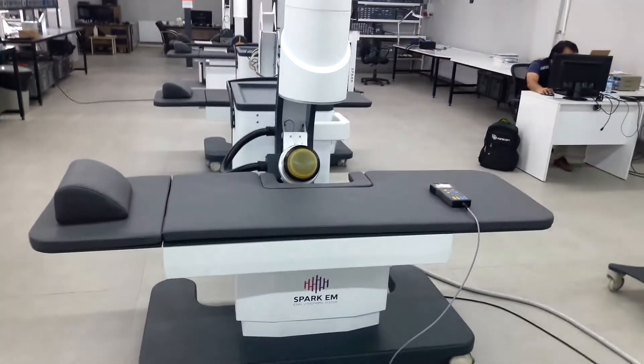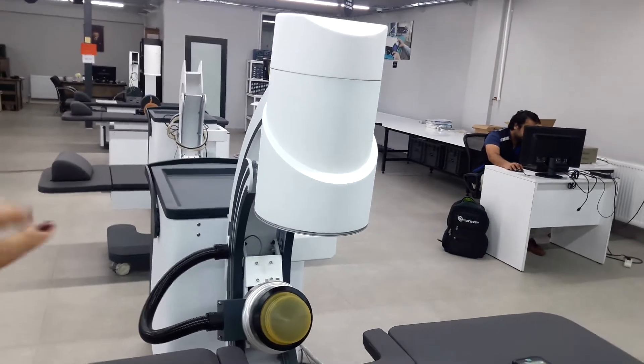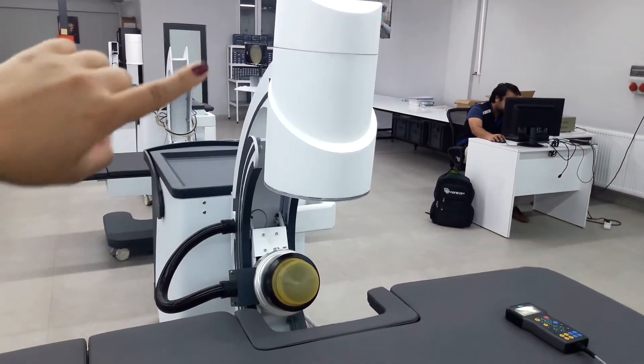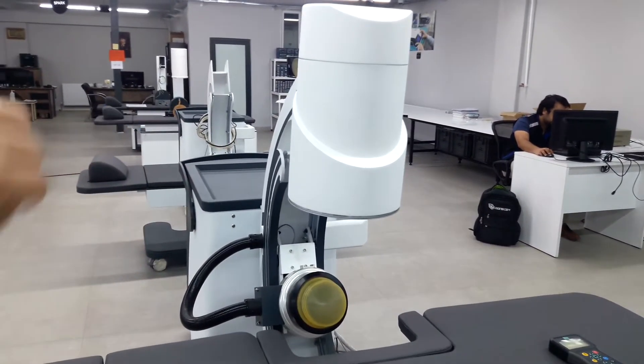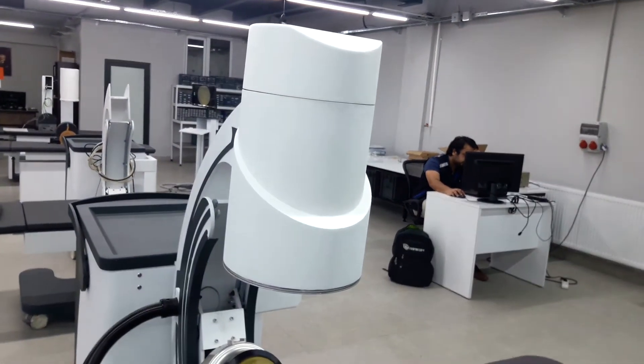We have the electromagnetic model, Spark EM. It has a 9-inch fluoroscopy C-arm imaging system. If you want, we can also produce a 6-inch fluoroscopy.